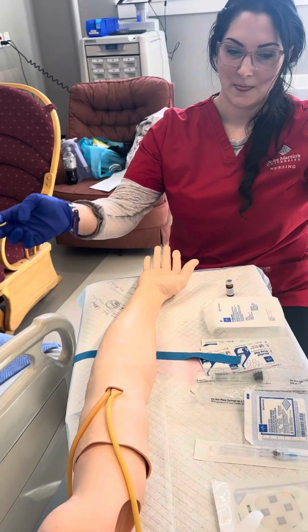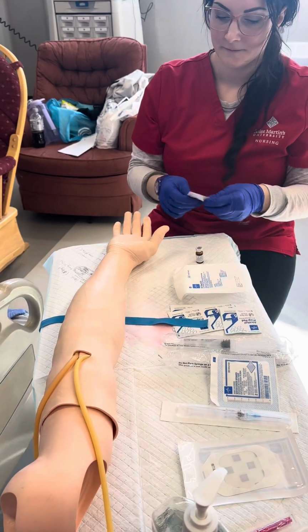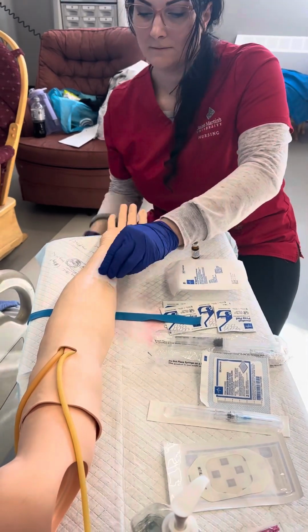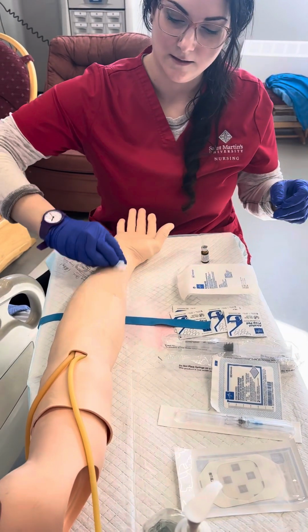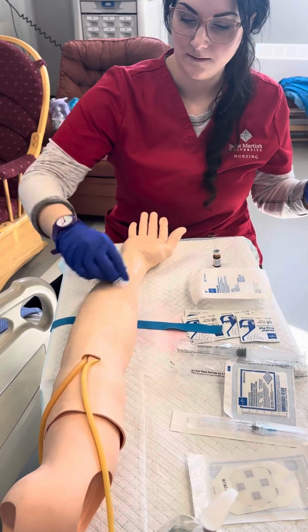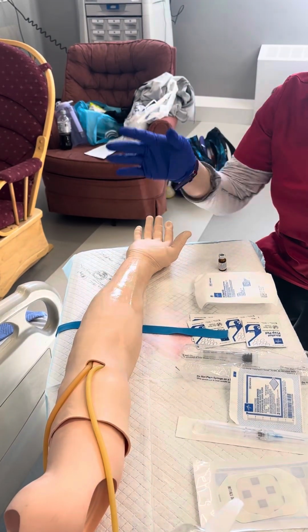All right, go ahead and clean you up. About 30 seconds. Okay, let that dry.